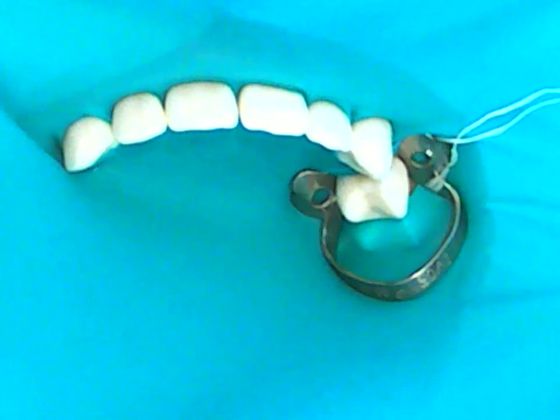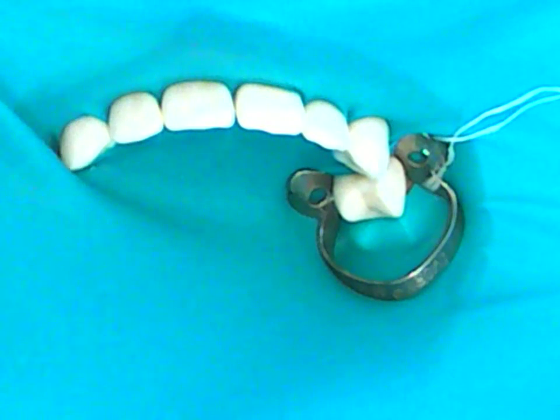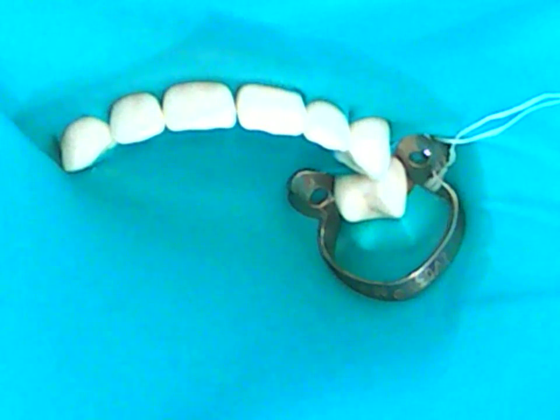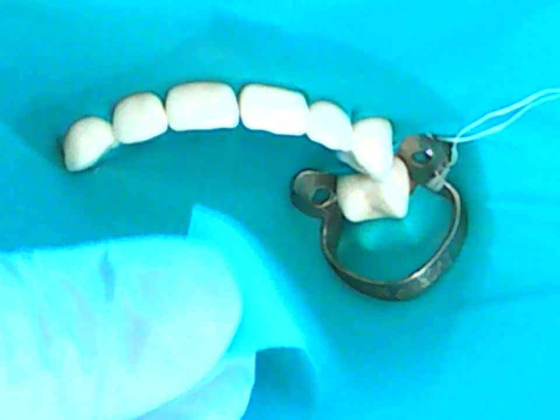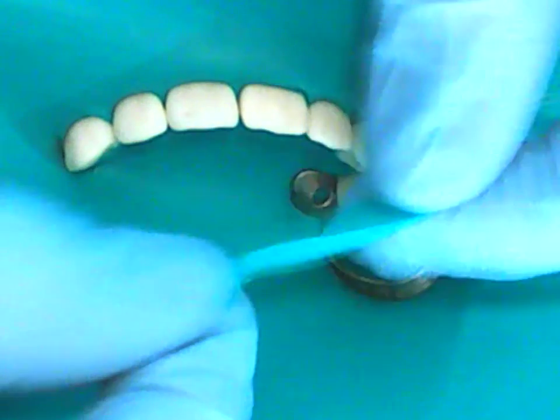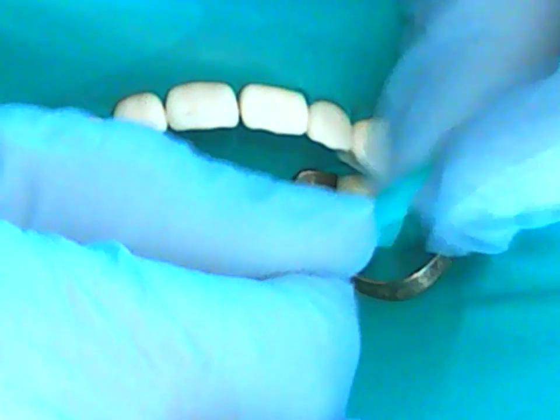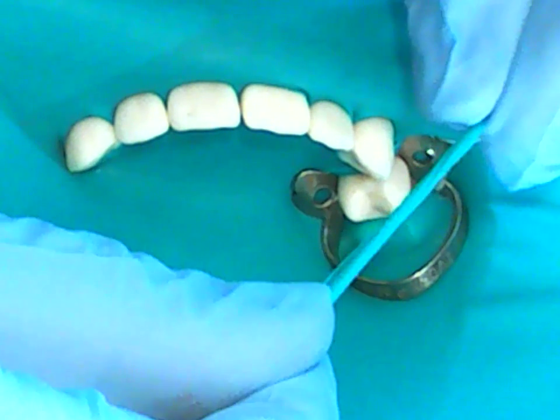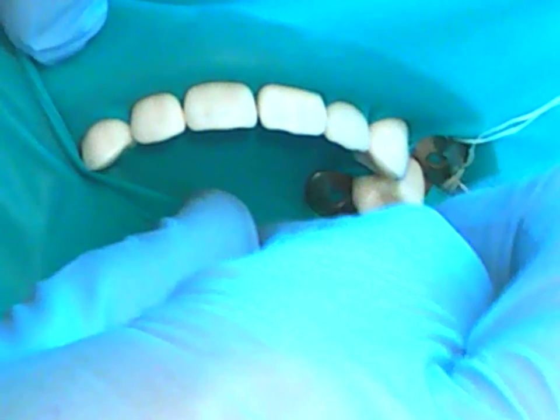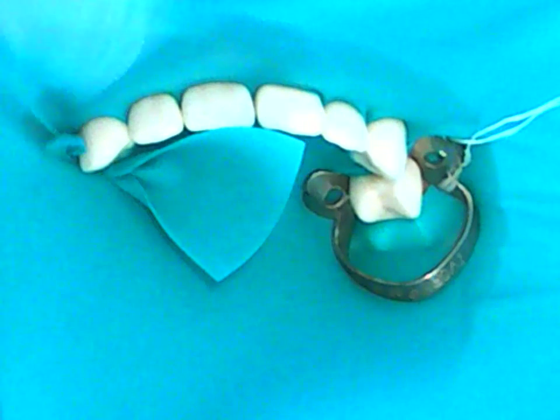Okay, another option is using a corner of your dental dam. So I'm just going to snip. Can't see this, unfortunately, I'm sorry about that, but I just snipped a corner of the existing dental dam that's on this client right now. Just a little triangle, doesn't have to be pretty. Fold it in half, and just give it a little twist. So it looks something like that. And you just simply go back and forth, similar to how you would floss. You'll feel it go through the contact, and that's it.